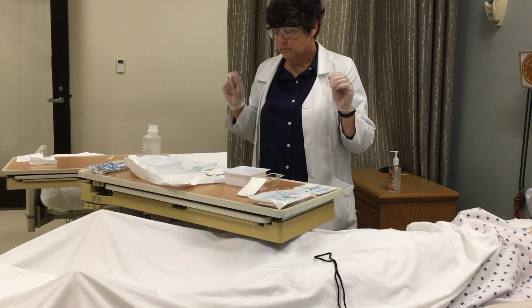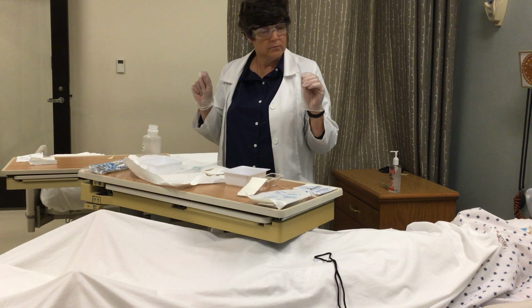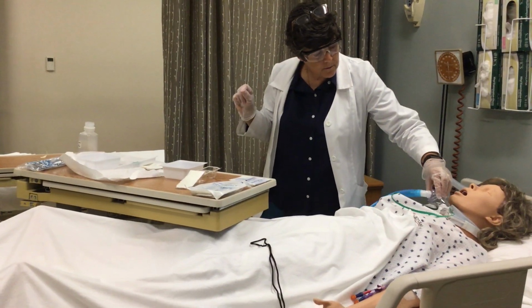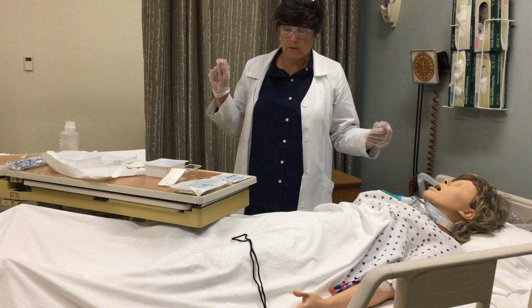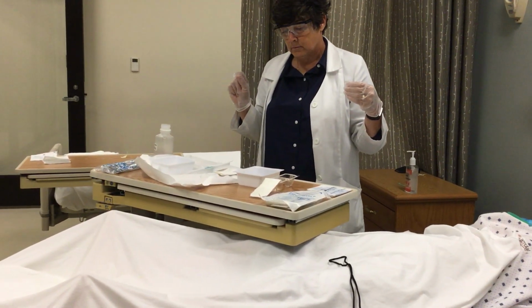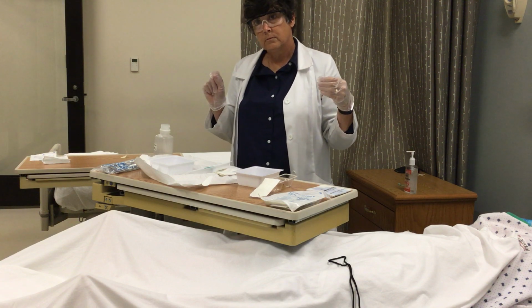If necessary, replace the tracheostomy collar, T-tube, or ventilator oxygen source over the outer cannula. If that were the case, I could put Miss Cruiser's trach collar back over that opening and have her take some deep breaths. Quickly pick up the inner cannula and use a sterile brush to remove secretions from inside and outside the inner cannula.